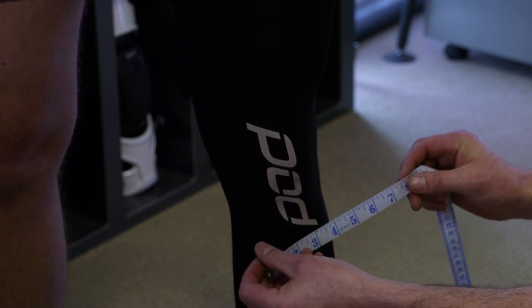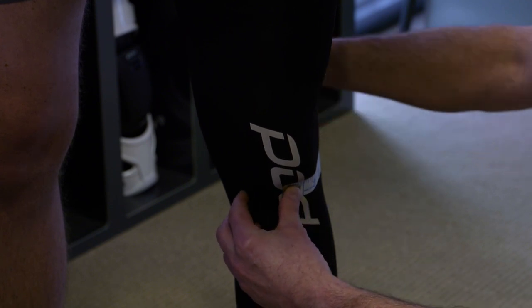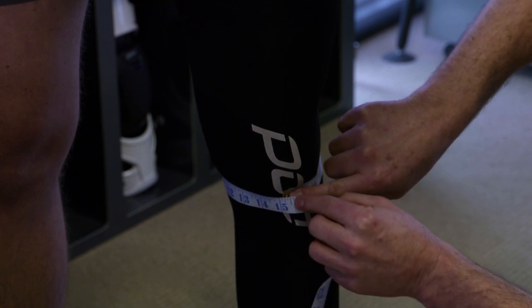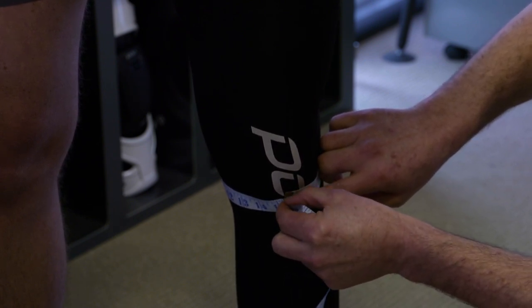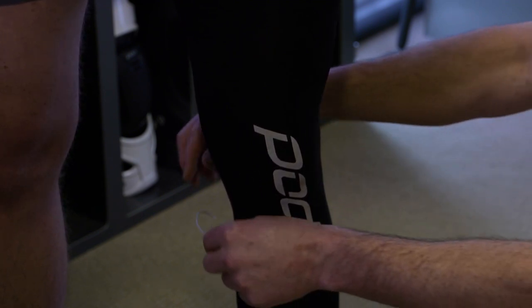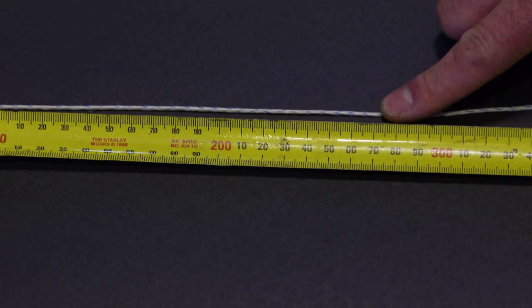You'll measure the circumference of your knee just below the patella — the kneecap — right at the base of the kneecap. Wrap the tape around the knee and look at either the metric or imperial system — inches or centimeters. We have both sizes at podactive.com. If you don't have a soft tape, you can use a piece of string or wool to wrap around the knee at that same spot, then note where it finishes and compare it to a standard tape measure.